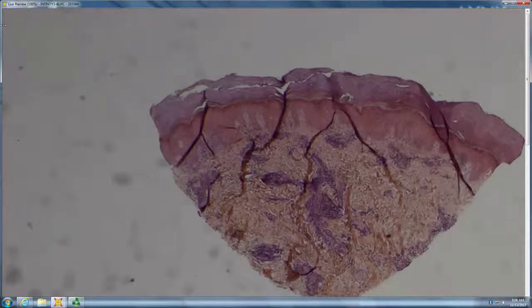So probably a big-vessel type of vasculitis in the late stage where you still see vessel damage and you still have some debris, but the whole thing's healing. So this is a late stage of a deep leukocytoclastic vasculitis. So you'd need to check ANCAs, find out if they're healing after a septic vasculitis, an RF, or rheumatoid vasculitis, yeah. Although rheumatoid vasculitis usually eventuates in ulcer.